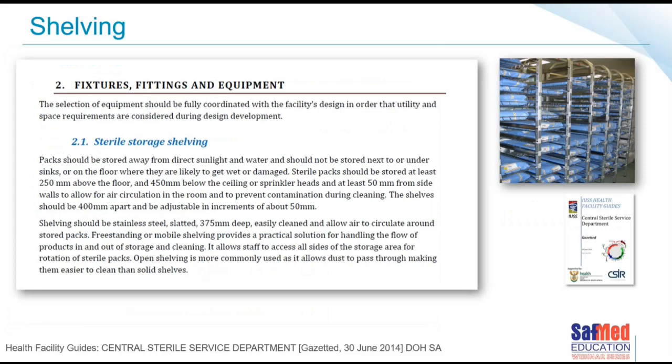I asked the question earlier, does the shelving matter? Absolutely. In the section Fixtures, Fittings and Equipment in the guidelines, there is a very specific section on sterile storage shelving. Okay, so remember this. Remember there's a test.